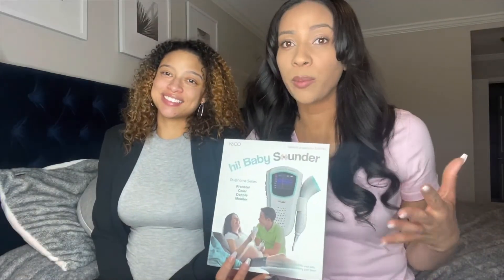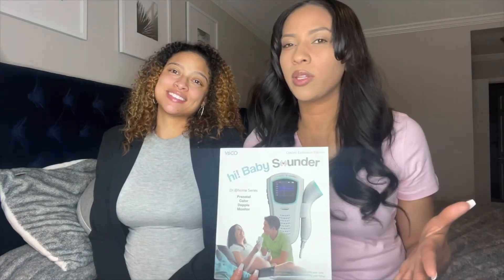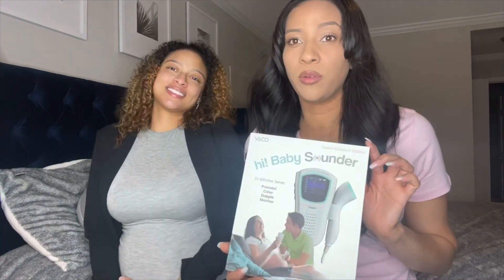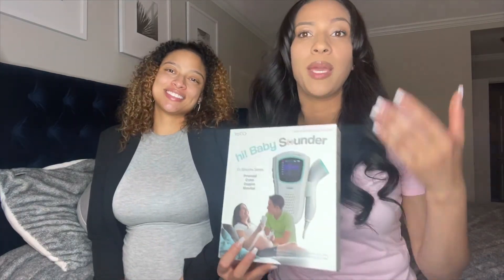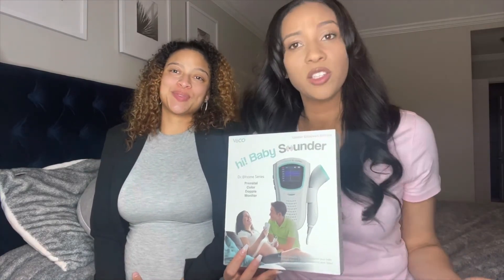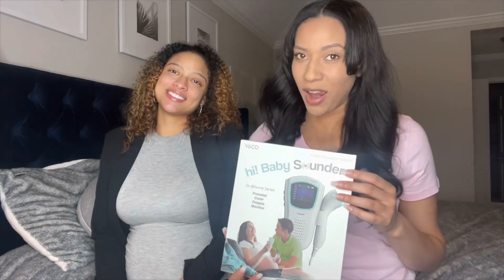Baby's health is so important, so to be able to hear the heartbeat at any time really gives you that peace of mind. This is a highly sensitive ultrasound unit that's capable of picking up the baby's heartbeat as early as 16 weeks. It's easy to use, accurate, and provides immediate results — we definitely recommend this product.